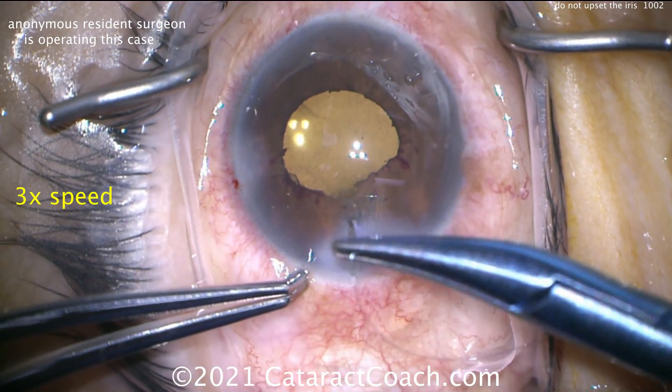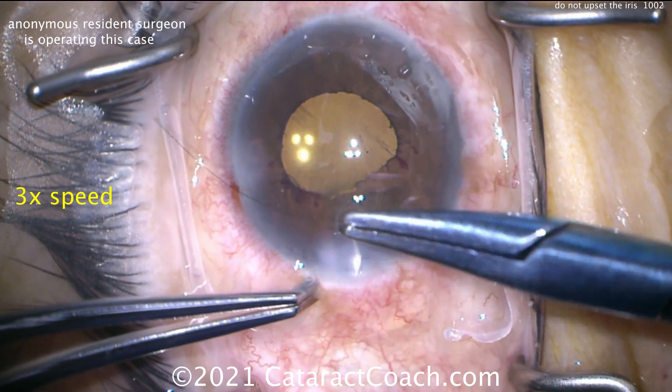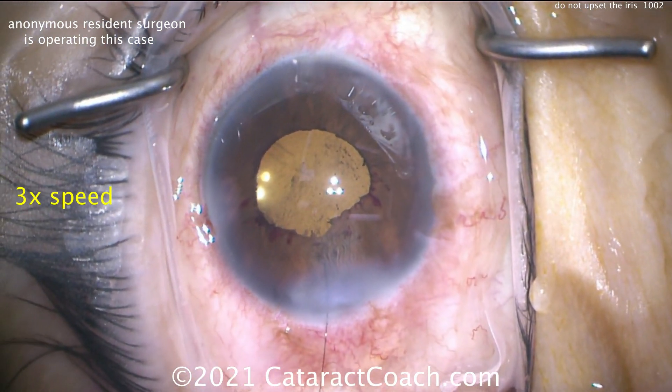Grab the tissues, nice and gentle, put that suture in. This has been a fun case — I trust that you've learned a lot. The take-home lesson: do not touch the iris. Don't upset it.